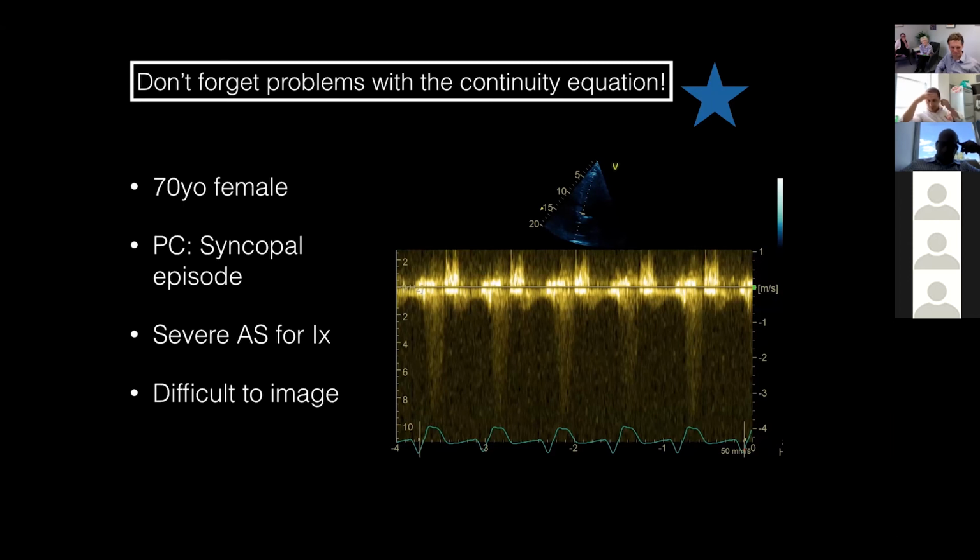So the Doppler profile is terribly bad. It's well aligned on the 2D image, but it's having a lot of fuzz, a lot of background, so definitely the gain needs to be much reduced. I can't really appreciate the opening and closing clicks. Maybe the opening click, yes, but not much of the closing click. But at least on the 2D image, it looks within the valve.